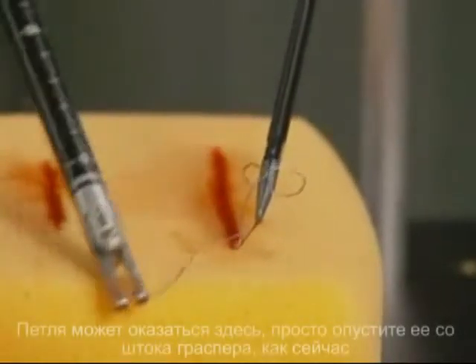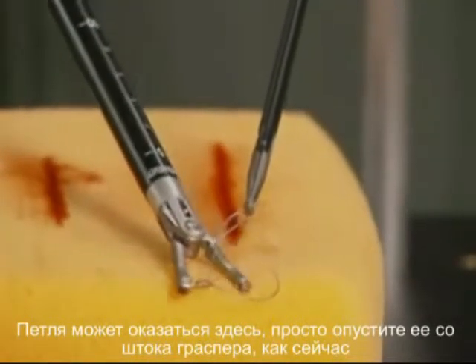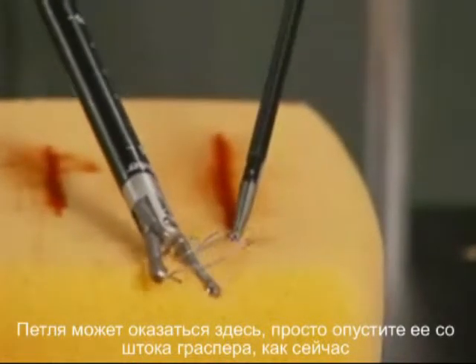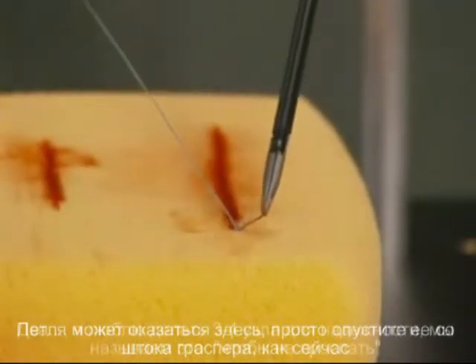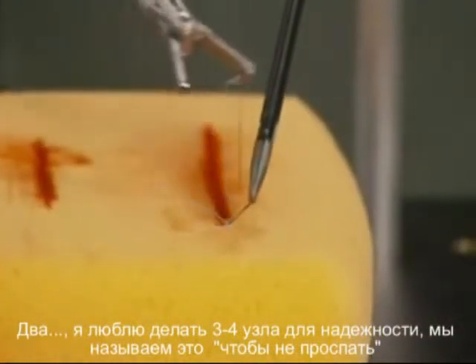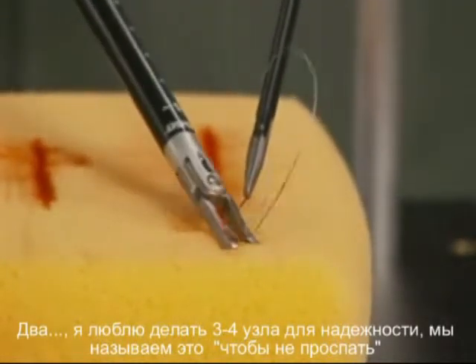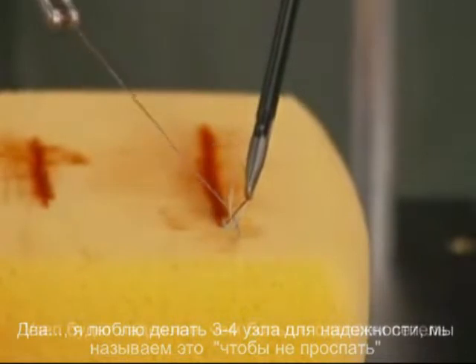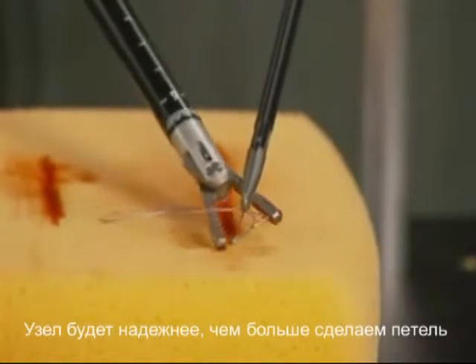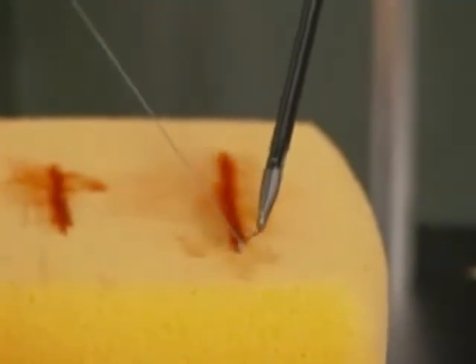If the loop gets caught up here, it's not a big problem — just bring it down. If it goes up the shaft, just pull it down and tighten it. That's two. I like to have at least three or four throws. That was a miss right there — we call that a swing and a miss. There we go, three. Notice I'm watching my loop as we go.